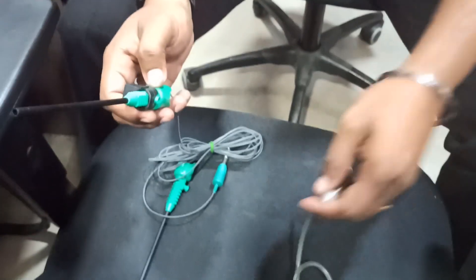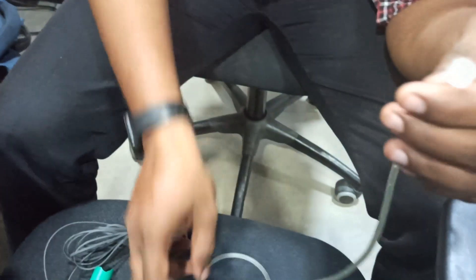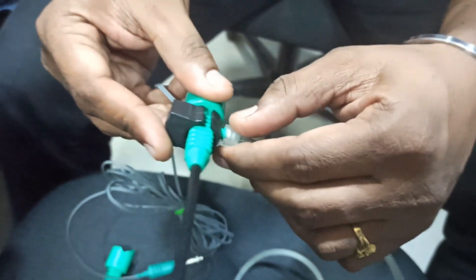Once you fix the finger switch, take the irrigation tube. It has two ends: one end goes to the irrigation, which is saline water, and the other end connects to the sheath. It has a thread, so just seat it over here and gently tighten it.